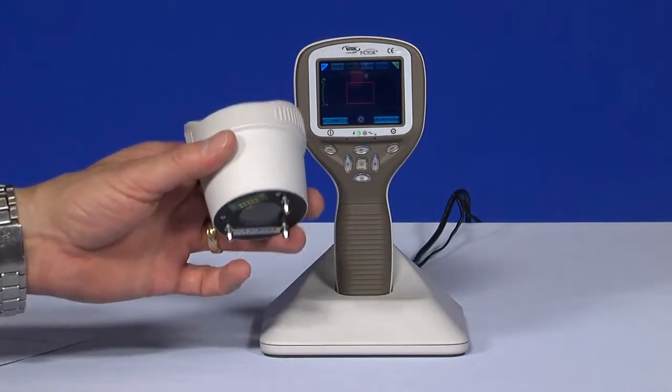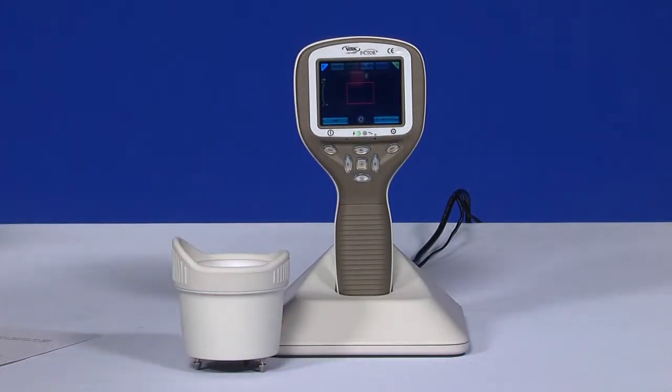The anterior module has two light sources: white and cobalt blue light. You can choose between the light sources by pressing the left soft key when the anterior module is attached. Cobalt blue light enables you to take fluorescent pictures of the surface of the eye to reveal any cuts or defects.